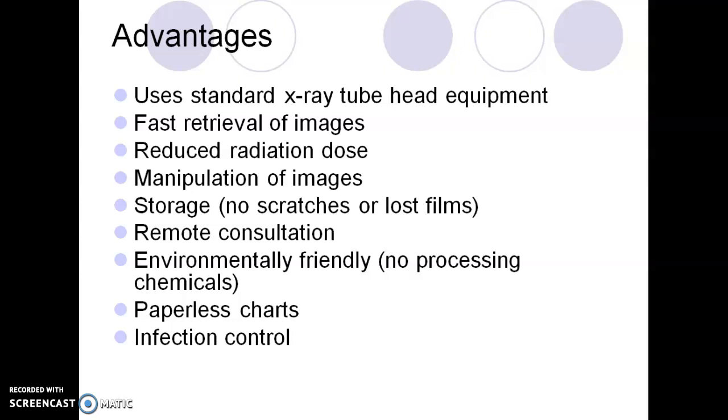Advantages for storage because there's no scratching, no lost films. You don't end up at the end of the day with 2 or 3 films just on the floor loose. They've fallen out of the mount, they've fallen out of the patient's chart, and you don't know who they belong to by the end of the day. Plus, from patient visit to patient visit, there's no scratches or damage to the images themselves.